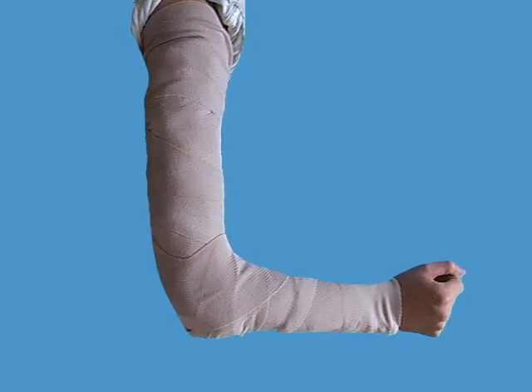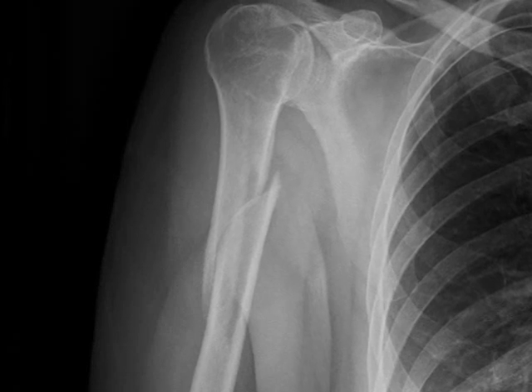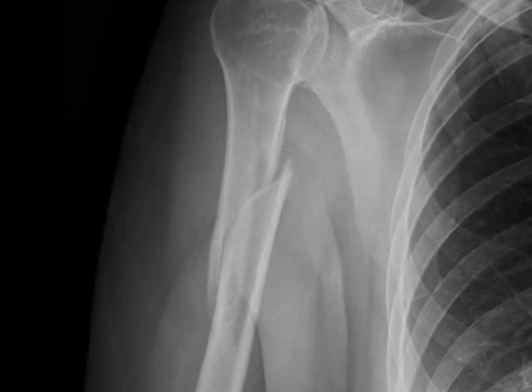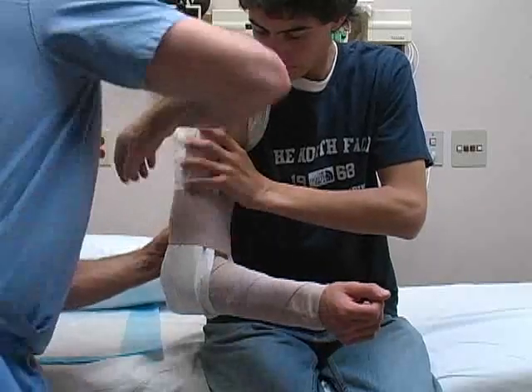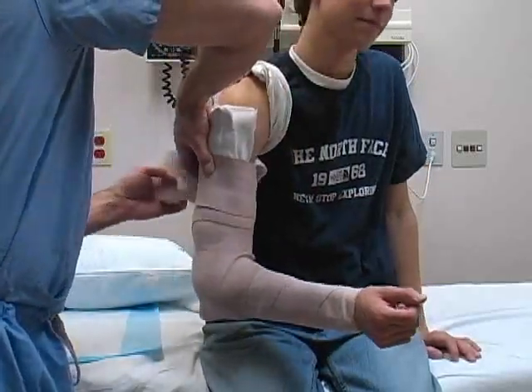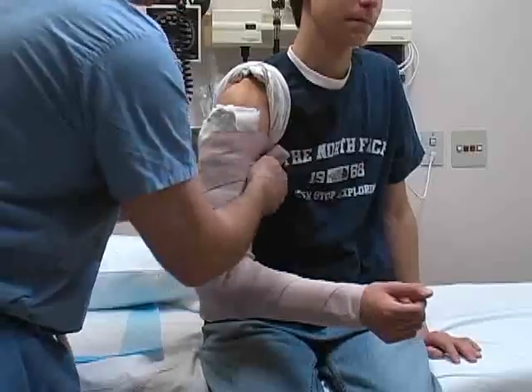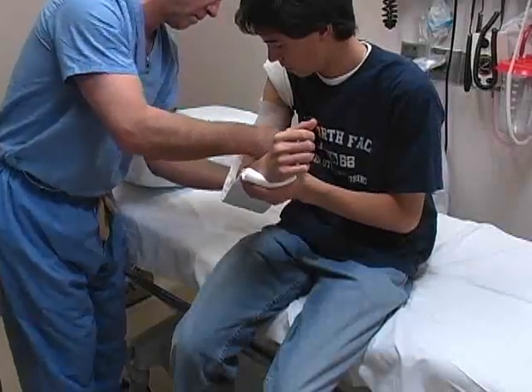The coaptation splint is used to immobilize the humerus. Most frequently, the splint is used for fractures of the humeral diaphysis, such as the oblique mid-shaft humerus fracture depicted here. The coaptation splint may be used in isolation or combined with a posterior long arm splint. The application of a long arm splint is covered in a separate video.